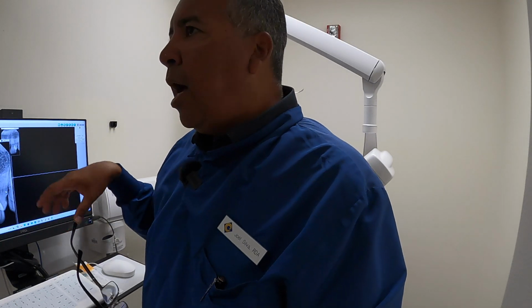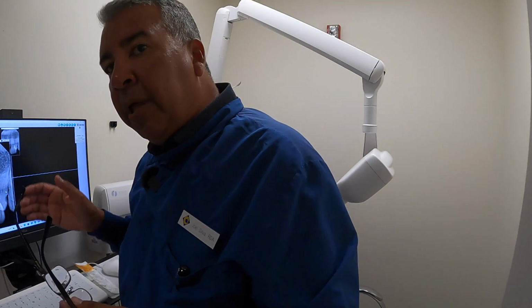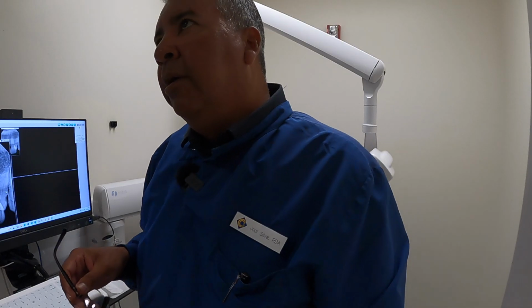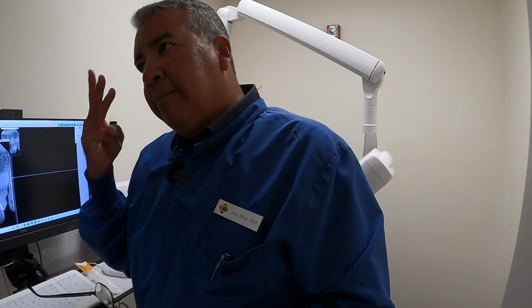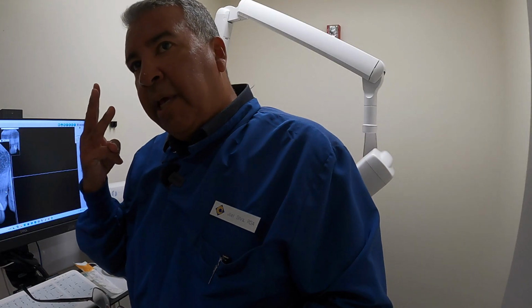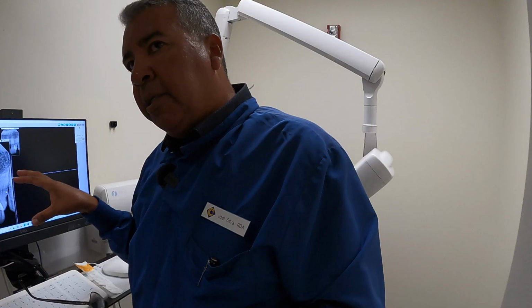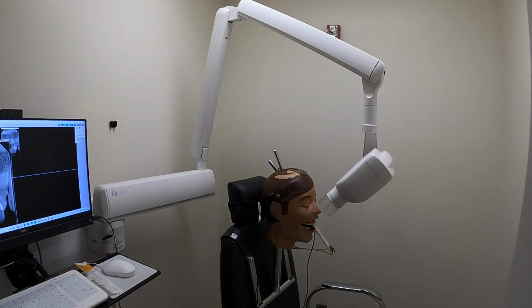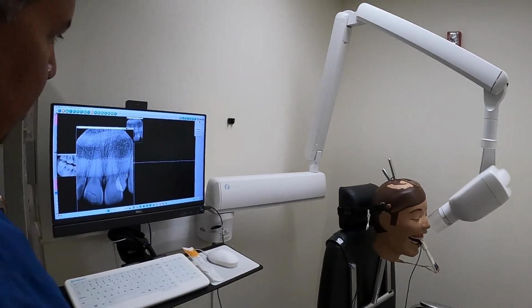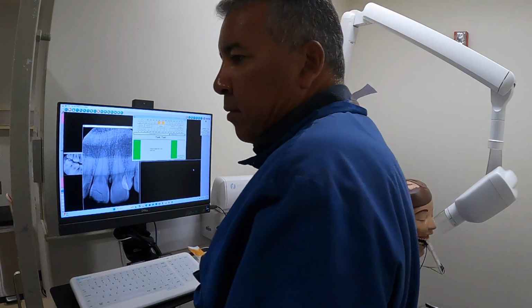Because if you go the opposite way, you're going to lose that apex, and then no matter what, you got to redo that whole tooth. And remember, how many retakes can we do on a patient? 3. Yeah, you can do up to 3 retakes on a patient. But I want to minimize the mistakes that you guys have to make by doing that. So let's see what that looks like. It shouldn't be that much different, but it's enough to give you a little bit more. So let me press repeat. We'll retake that.